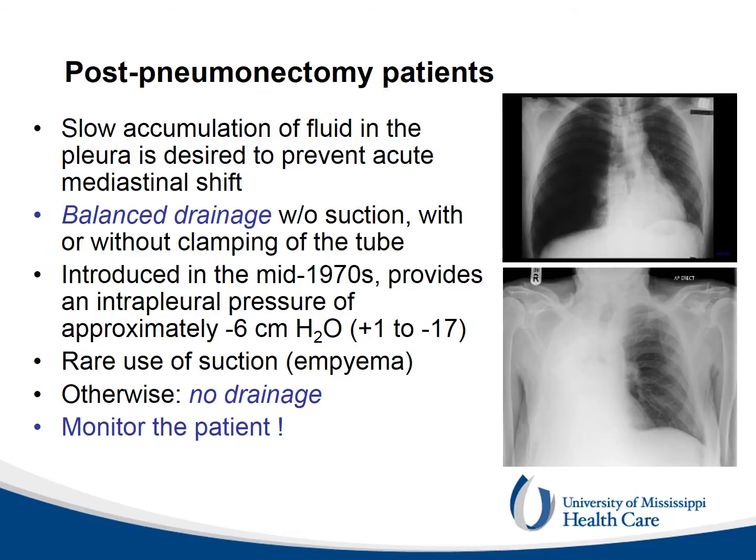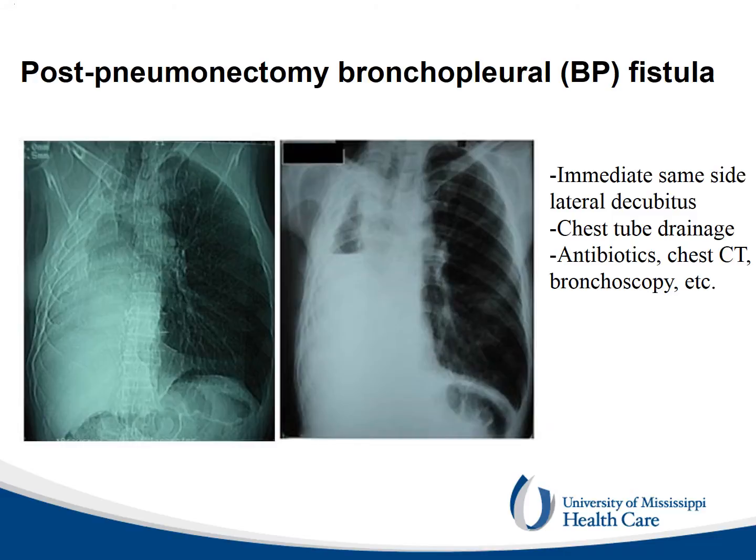Suction is rarely used, mainly for empyema present before the pneumonectomy. Other surgeons prefer no drainage. Most important, monitor the patient clinically and with frequent chest X-rays. After a pneumonectomy, the empty pleural space fills with plasma fluid.